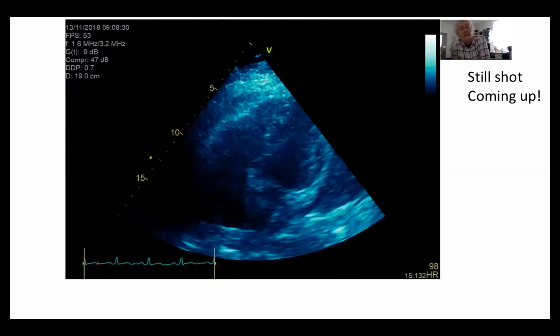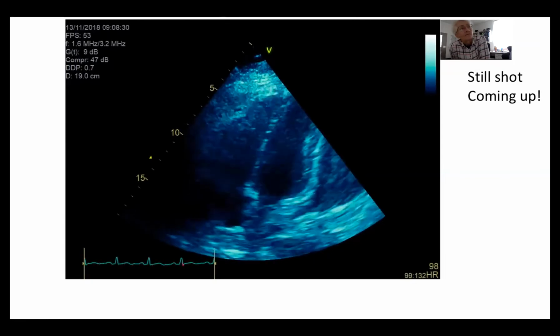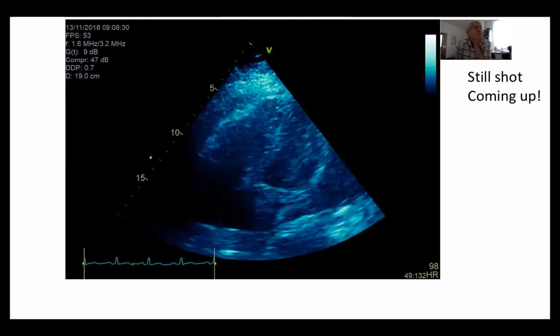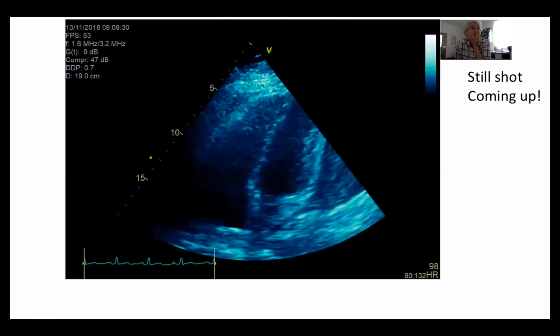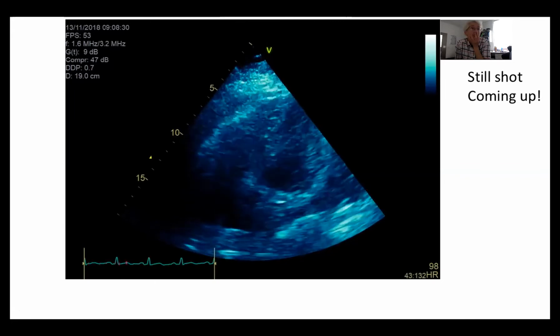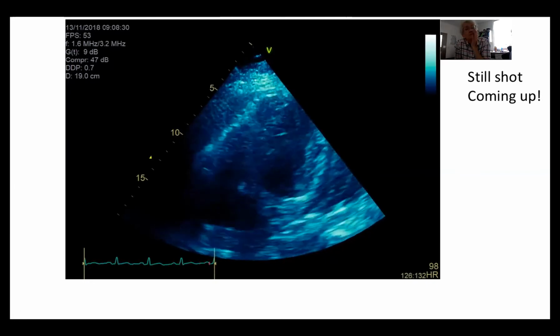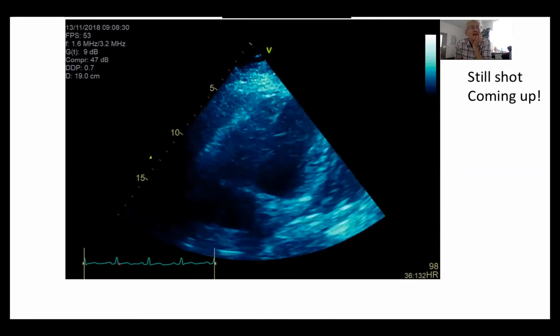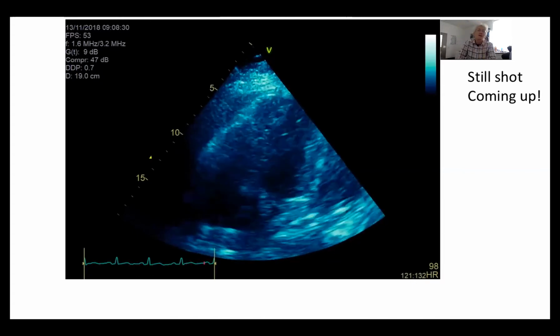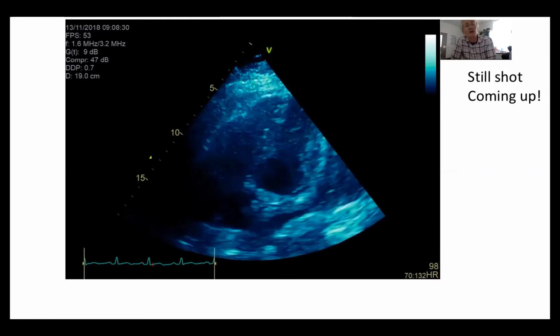So Arnie, what do you think of this? I'm wondering whether we see as well some early diastolic collapse of the RV as we saw on your M mode. The LA, I'm wondering whether it's just strongly cut or whether it's just collapsing as well, which also would suggest decreased volume going across the pulmonary circulation. So I can't quite see the right atrium here. No, we never actually got a good right atrial shot. Otherwise, I would have shown it to you.